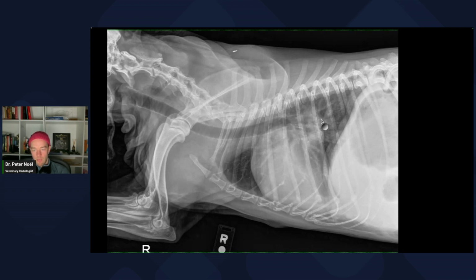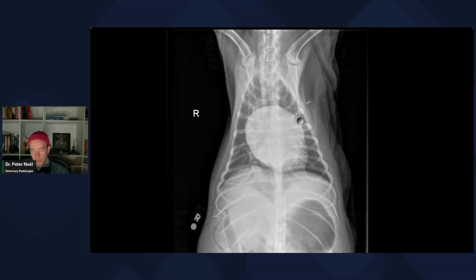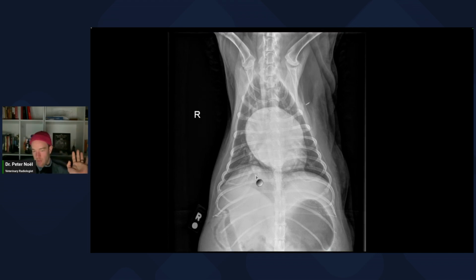So this is a big old cardiac silhouette. I'll flip over and show you on the VD view, the left auricle at 2 to 3 o'clock, a subtle bulge. The dog's rotated a little bit. There's his sternum. You don't see the teardrops. So he's a little bit cocked to one side, but there's a subtle bulge. I wonder if you straighten him up, it gets a little more bulgy. The right caudal lung lobe kind of caught my attention for maybe subtle edema, but I wasn't really sure.